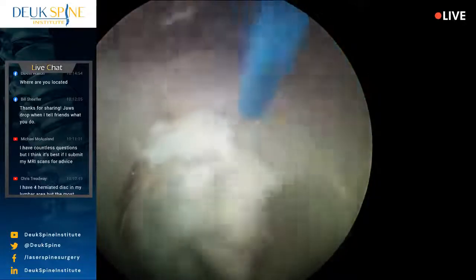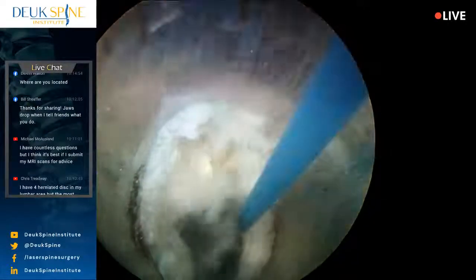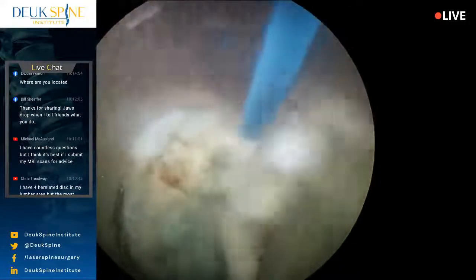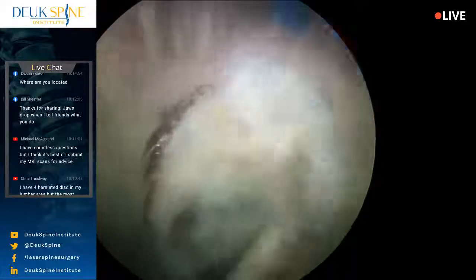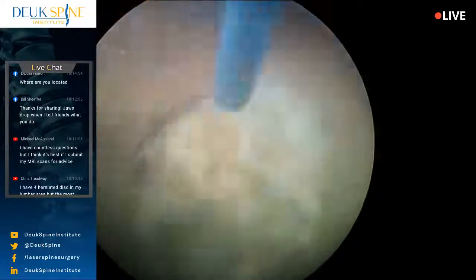Wow, herniations galore here. That's amazing. This disc was just really badly damaged. This is the one that, remember we did the discogram? There was a giant tear. Yeah, this was the 10 out of 10, giant tear. And this is that tear.